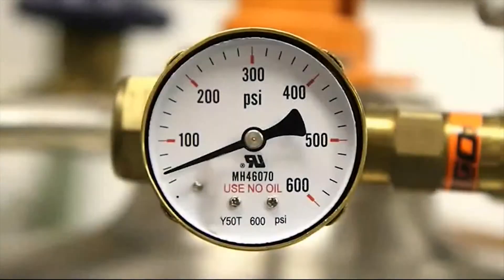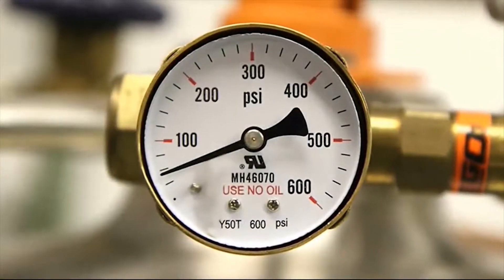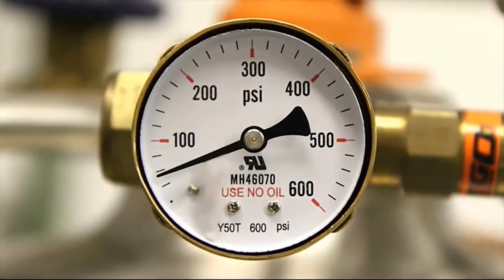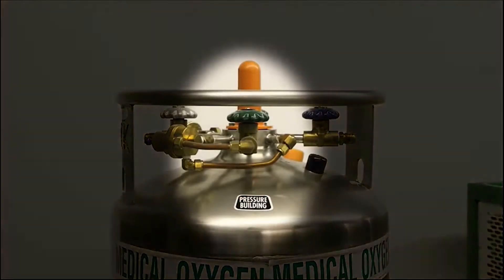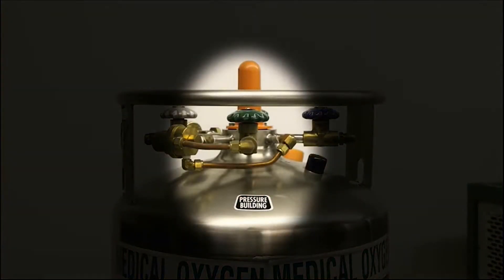To begin filling the MODS, the VGL pressure should be between 30 and 50 psig. When pressure is too low, open the pressure building valve. When pressure is too high, close the pressure building valve.